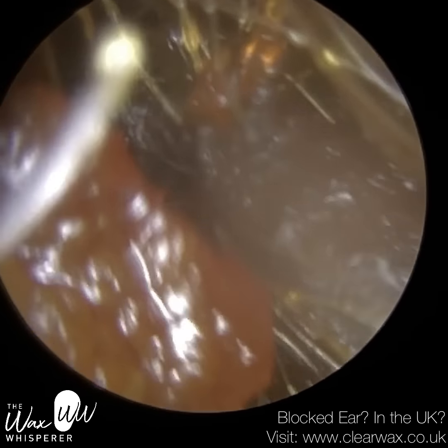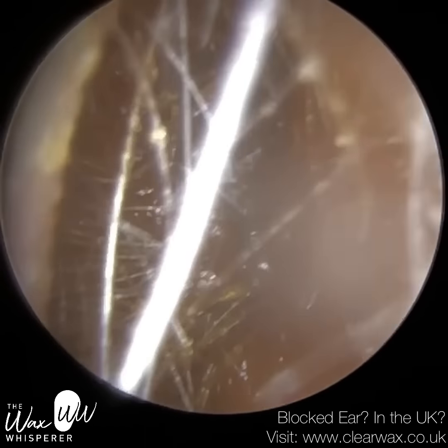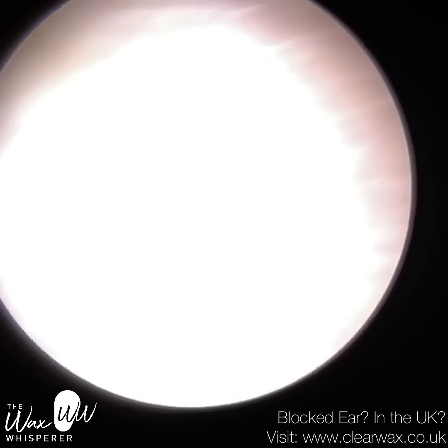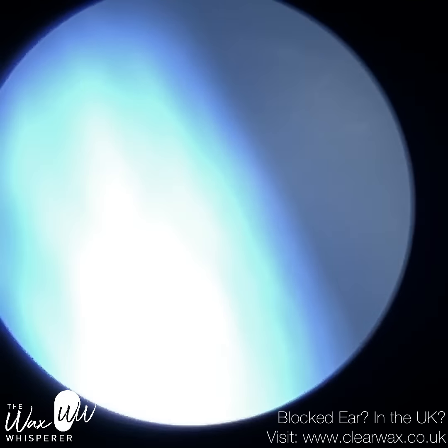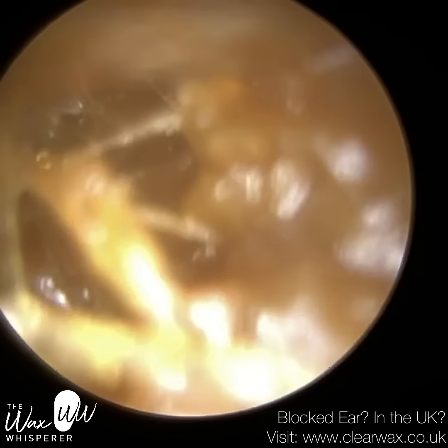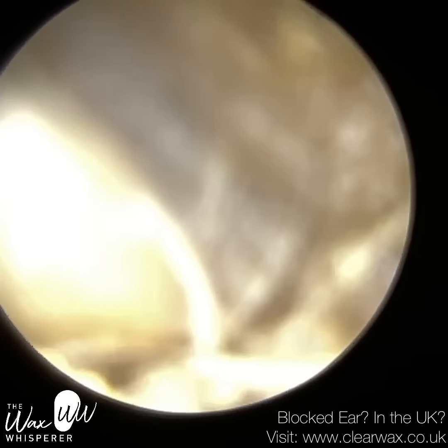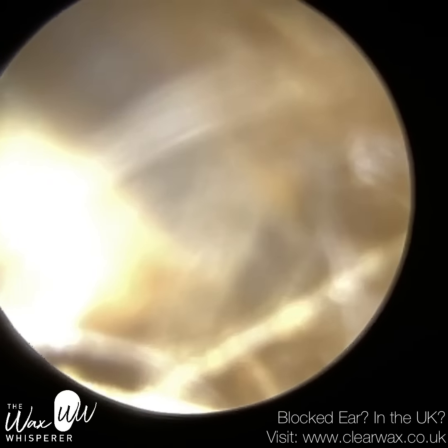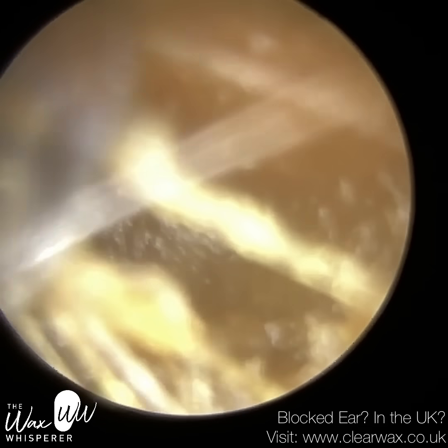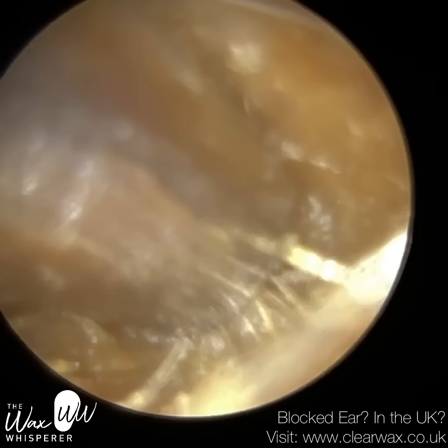We have here a very difficult and challenging case involving a patient who attended with bilateral, fully occluding, soft, mushy, glutinous earwax. In addition, they've got collapsed ear canal entrances, which makes it very difficult for me to examine, let alone insert the instrument inside their ear to remove the wax. I'll discuss the collapsed canals a bit later on in the video, just to explain the causes for that and potential remedies and solutions long term.